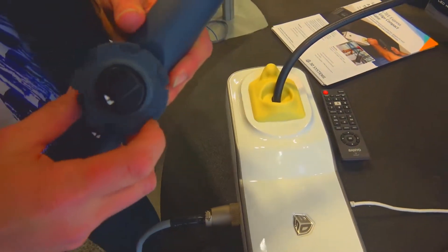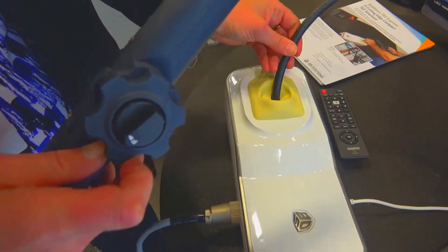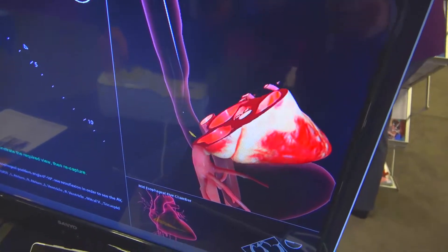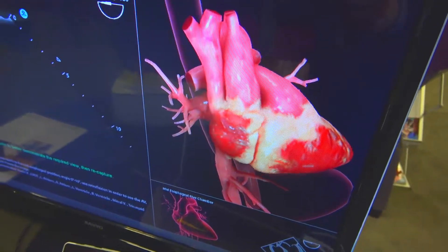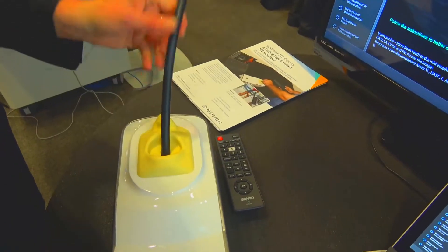The next new product that we are launching here is the TEE Express. It's a TEE scope with the system and it tells you basically how to capture all 28 views in TEE. If you are correct it will tell you, and if you're incorrect it will tell you. We also have where you can rotate this and all the standard views there.